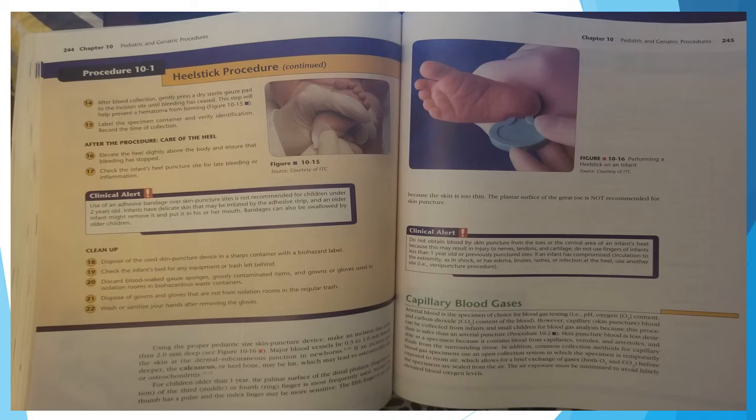For children older than 1 year, the palmar surface of the distal phalanx fingertip section of the third, middle, or fourth ring finger is most frequently used because the thumb has a pulse and the index finger may be more sensitive. The fifth finger is not used because the skin is too thin. The plantar surface of the great toe is not recommended for skin puncture.